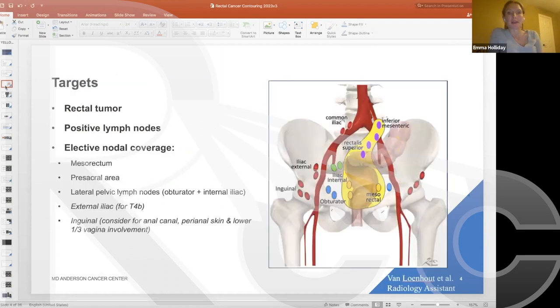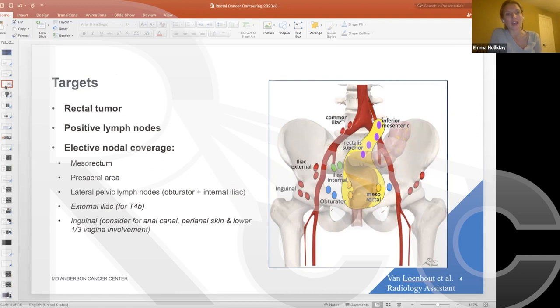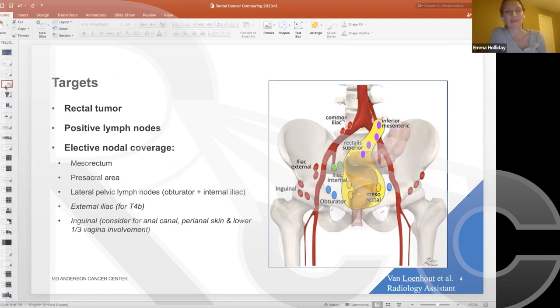In terms of rectal cancer targets, we obviously want to make sure the tumor itself is well covered in the preoperative setting, with generous coverage of any involved lymph nodes. Elective nodal coverage is also a big component — the majority of time spent in target delineation for me now is in outlining the elective nodal volumes.